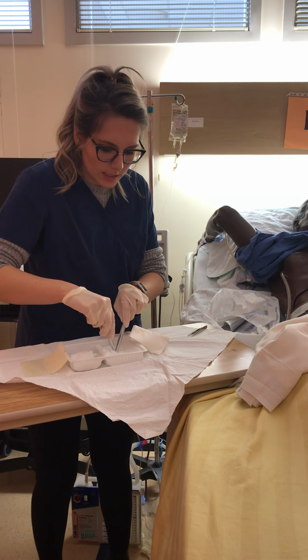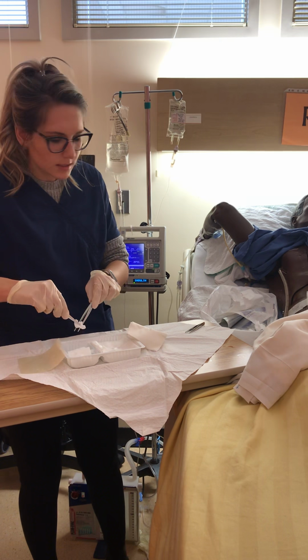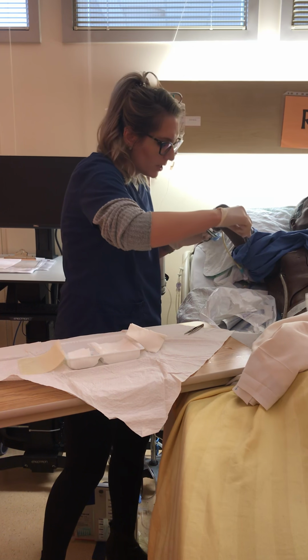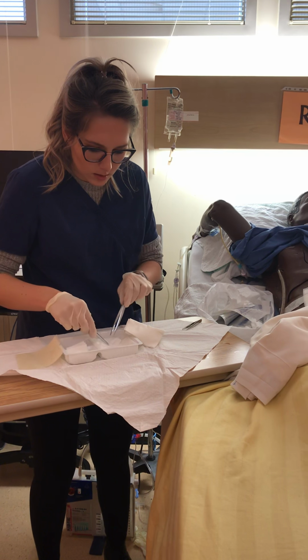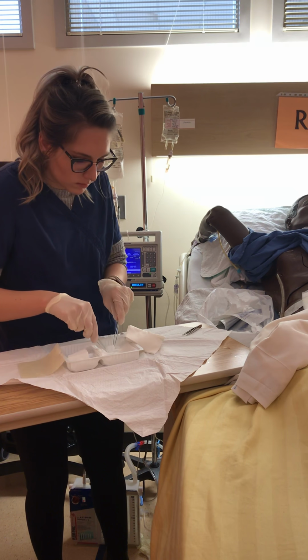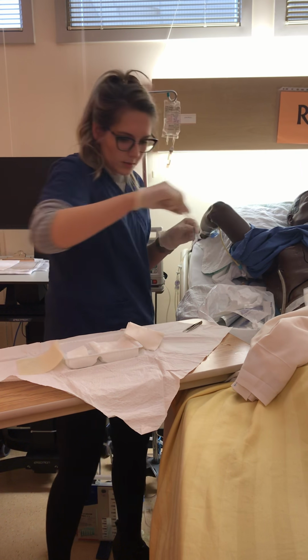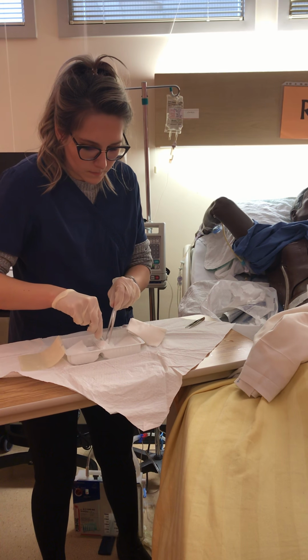And now I'm just going to cleanse the top of the tube. The bottom of the tube is stitched into my patient, so I'm just going to be very sure to move that top portion. Okay, so now I'm just going to start the drying process. This is squished out and dried off, so I'll just go down the length of the tube, keeping it one forceps swipe per swipe. I got underneath the tube when I did underneath the dressing.